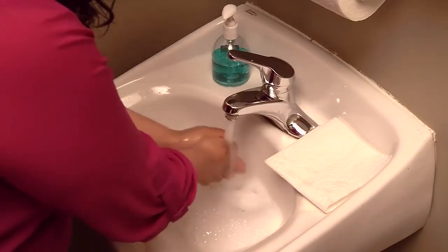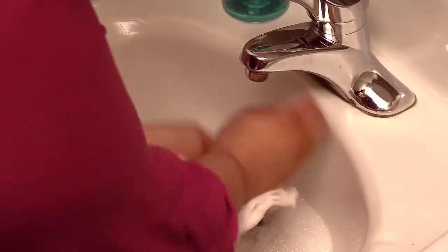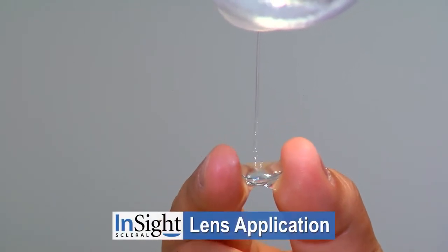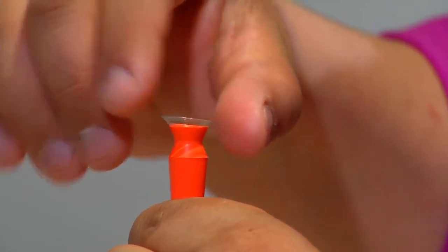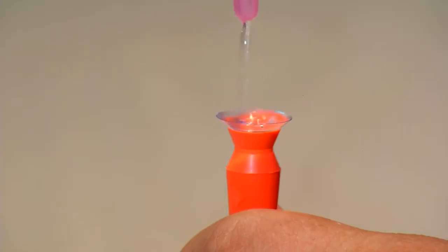When handling the InSight Scleral Lens, as with any contact lens, make sure to wash and dry your hands thoroughly. Thoroughly rinse the lens using a non-preserved or saline solution approved by your eye care practitioner. Place the rinsed lens on the suction cup and inspect the lens. Fill the bowl with non-preserved saline so that the lens is overfilled.